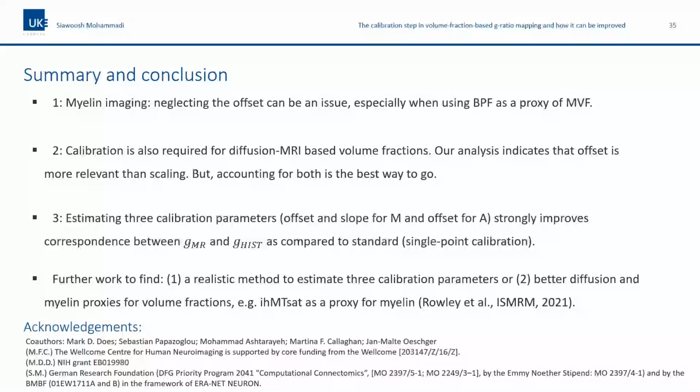In a way, the more specific you try to be, the less sensitive you are. Yes. So I think we could make a scale of just T1 mapping, myelin water imaging, and G ratio. When we're trying to do the G ratio, we have the most complex model. It might be very specific, but the sensitivity will be very poor because you're fitting so many things.